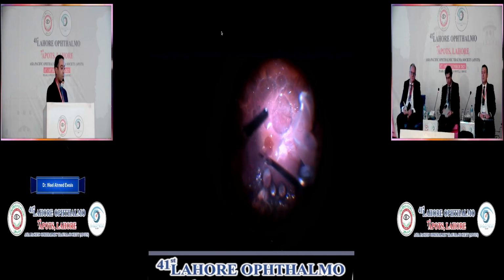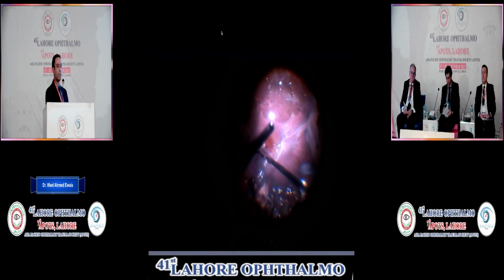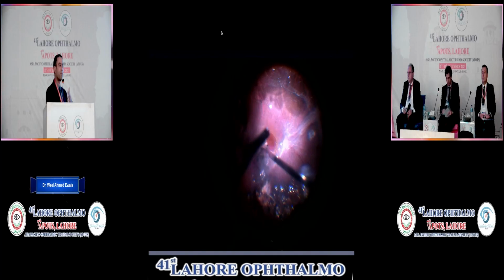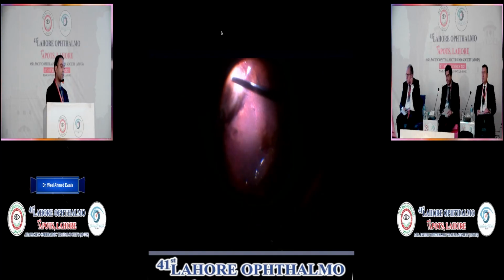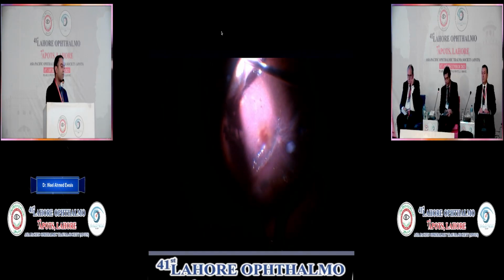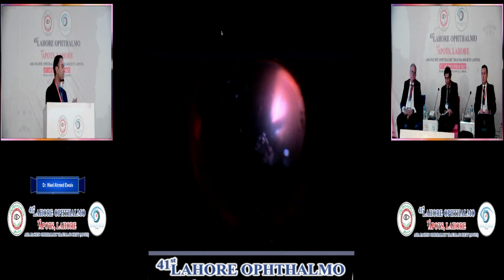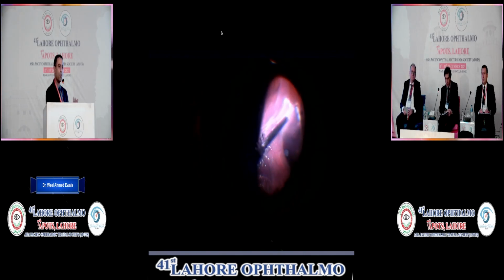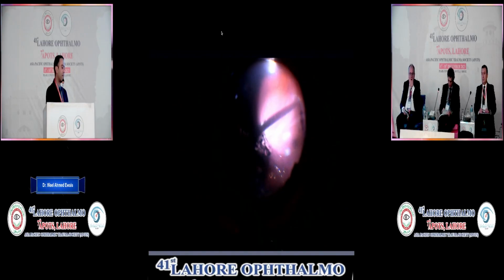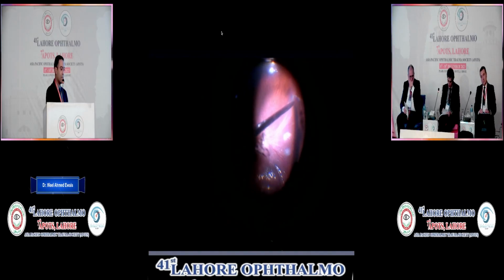And then with perfluorocarbon liquid, I tried to reattach and to reevaluate. Each step I'm doing in this surgery, I'm performing the step to reevaluate further steps. How can I do it? Of course, we all know and we are trained that there is no localized retinectomy. We do it either 180 or 360 retinectomy, but I had to do it in an untraditional way based on the situation.